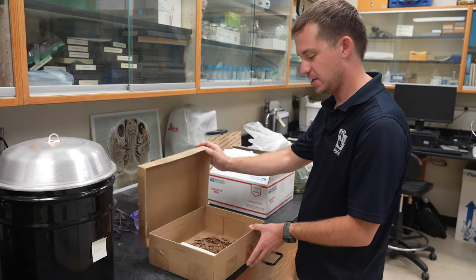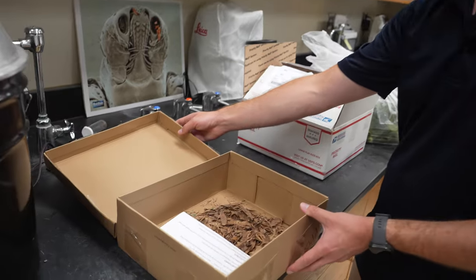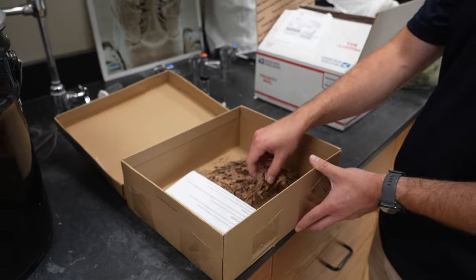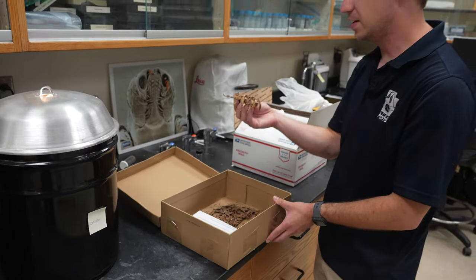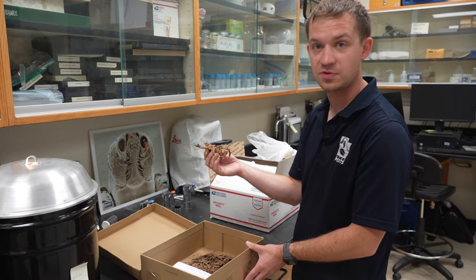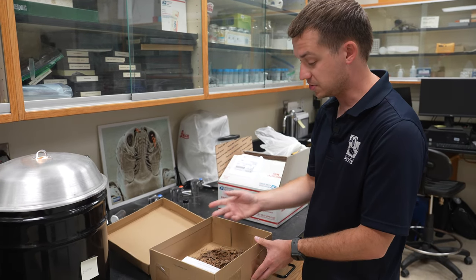Here we have a plant sample that came in that was not packaged or shipped properly. The plant material is not in a bag, the leaves are very dried up and crispy. We cannot do anything with this to run a diagnostic test — this sample is way too far gone. We need to see samples that are in better shape.